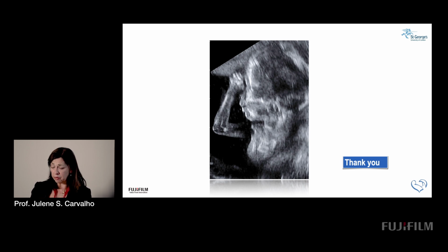So normally there is diastolic flow in the isthmus. The thing is how to quantify it. There is one paper looking at how much flow, the VTI, going in diastole and going in systole, doing a ratio. So it's not 100%, but it's one more way of trying to add the pieces to be more accurate with the diagnosis of coarctation, because there are quite a lot of false positives and false negatives.